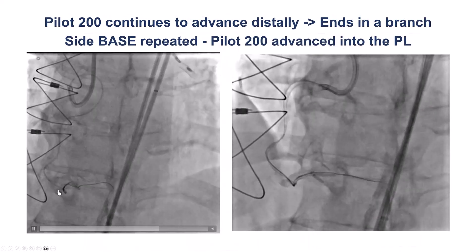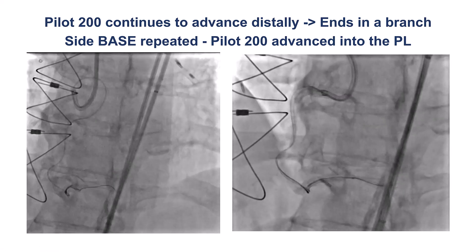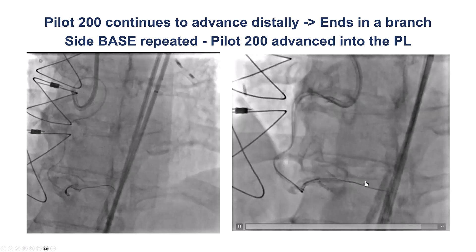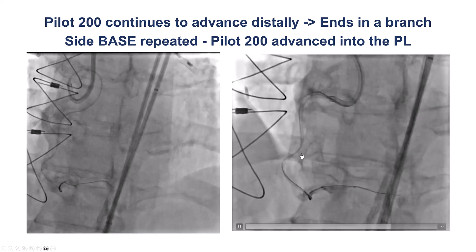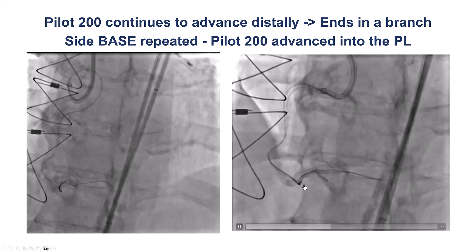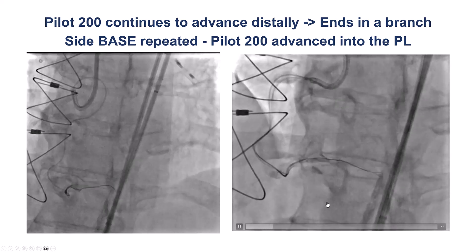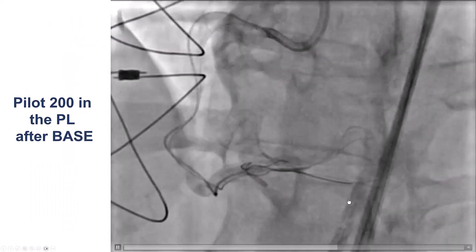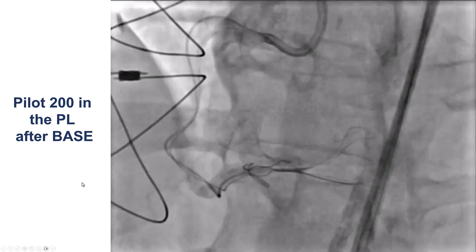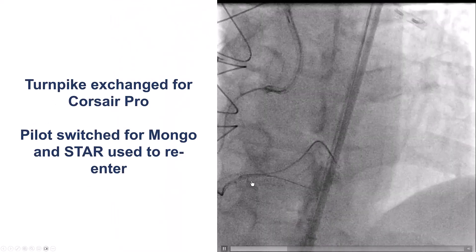We continued to dissect distally, but then got into a similar problem — the wire kept entering into a side branch. To avoid this, we did side-BASE again: we advanced a balloon and then used a Pilot 200 guide wire to track again into the right posterolateral, which eventually was successful.